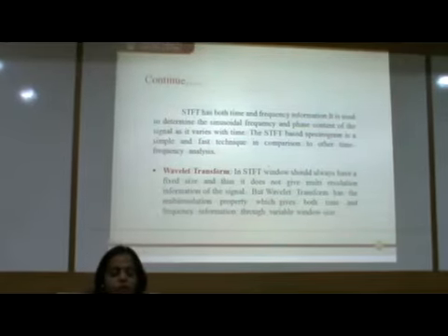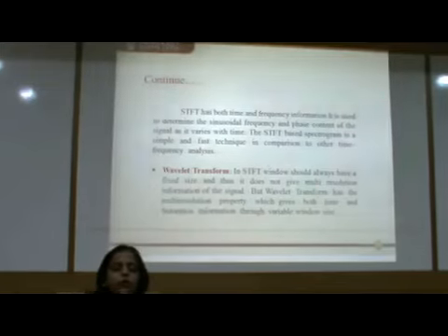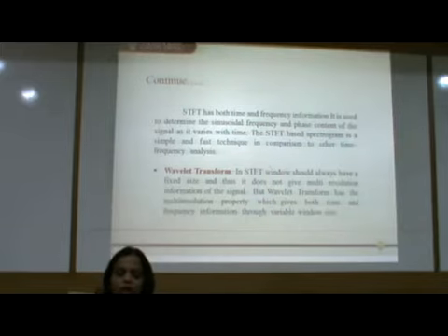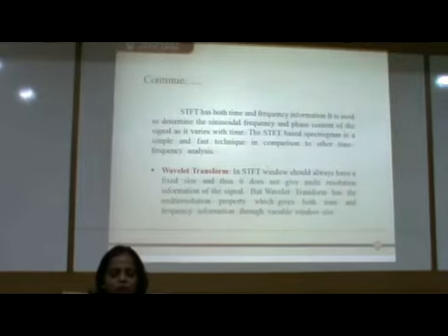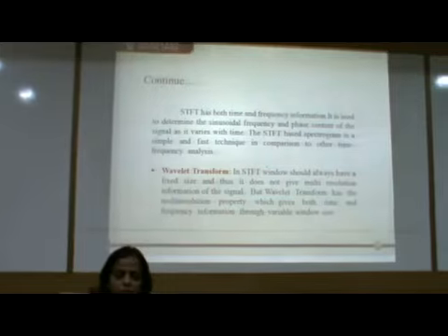Next technique for feature extraction is the wavelet transform. In STFT, windows always have a fixed size, and thus it does not give multi-resolution information of the signal. But the wavelet transform has the multi-resolution property, which gives both time and frequency information through variable window size.